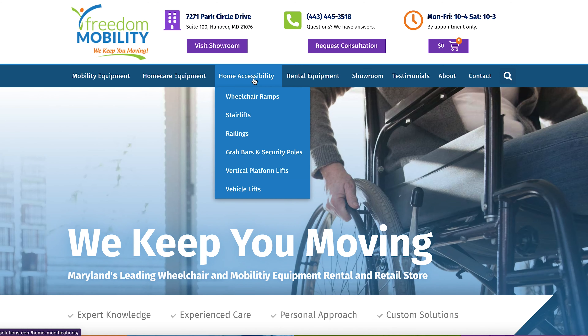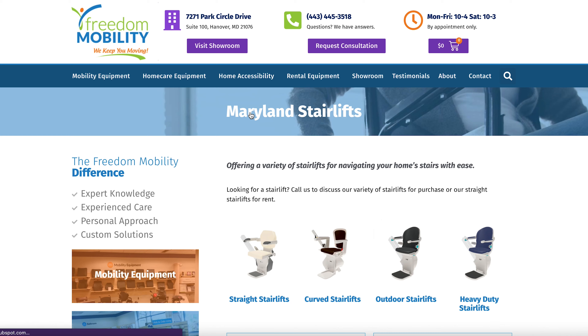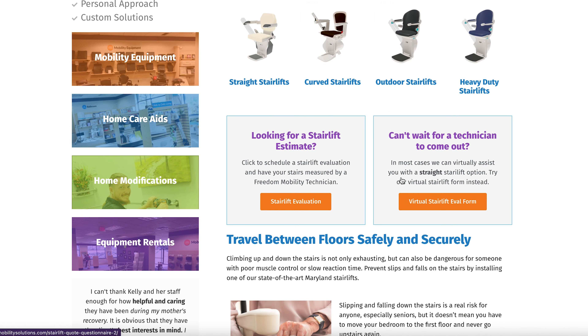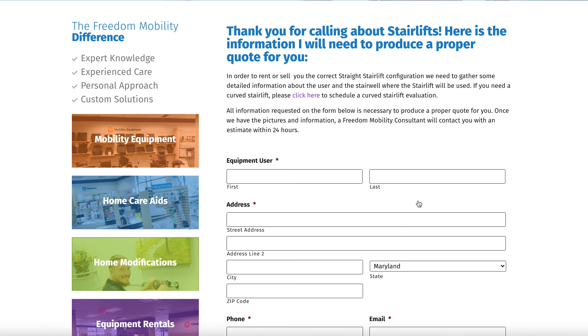Before the Freedom Mobility team can assist you in renting or buying a stair lift, you must give us the proper measurements and pictures required by the form.